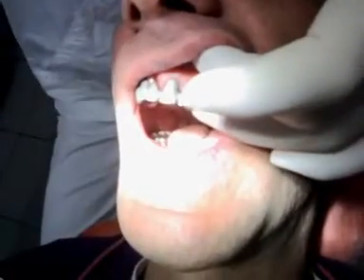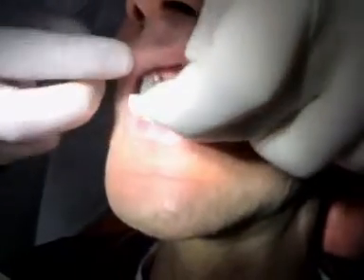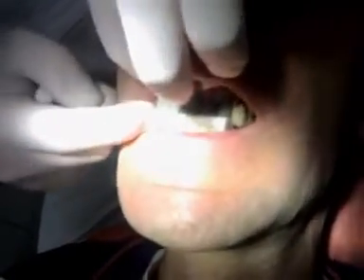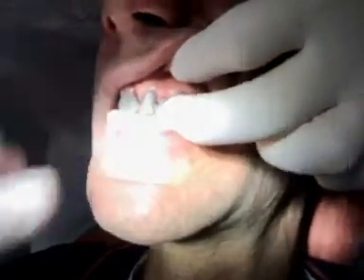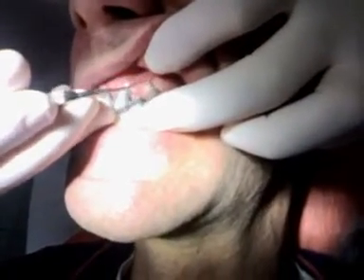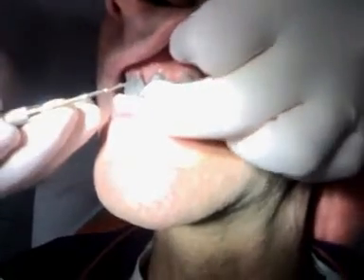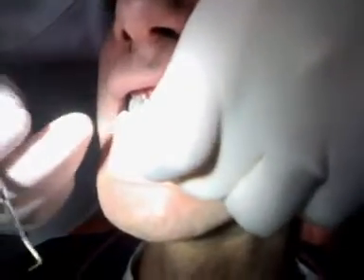It vacuums in when it seats. Now the patient is going to bite down. We're controlling our margins and the way they sit on the preparations. All right, let's open a little bit.